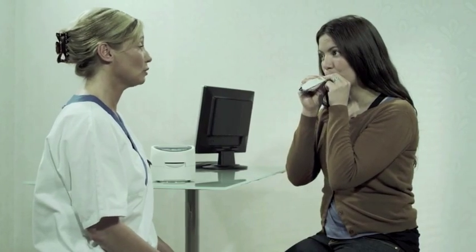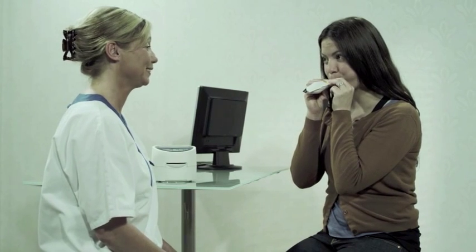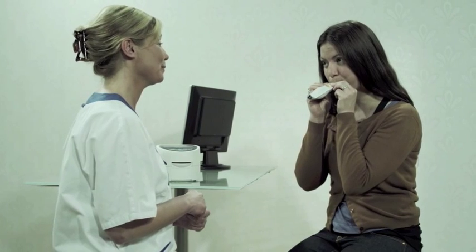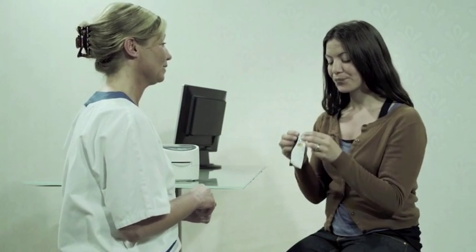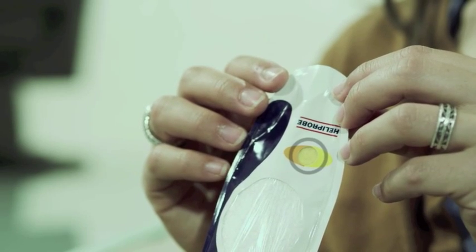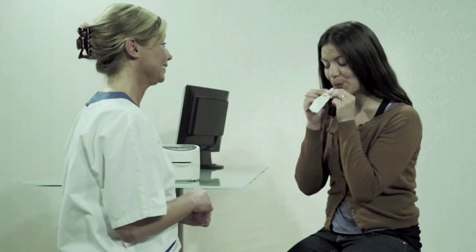Ask the patient to blow into the mouthpiece as if she was blowing a balloon up. Your patient should continue to blow into the breath card until the indicator changes color from orange to yellow. This usually takes about 2 to 3 minutes. The patient can pause for air as needed but should just blow, not inhale.